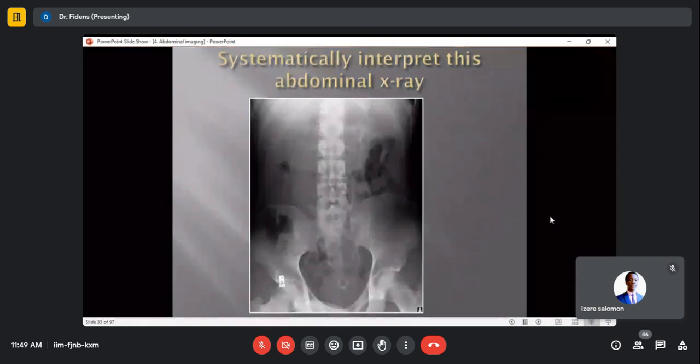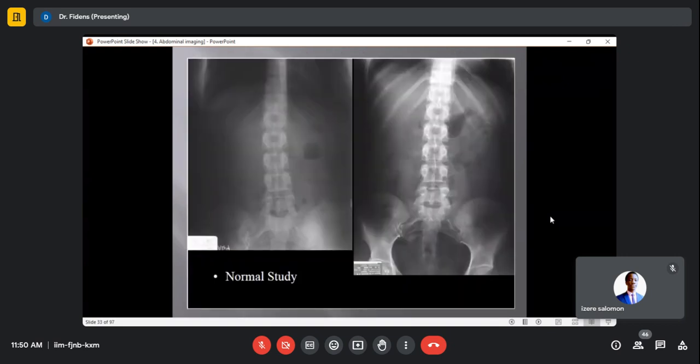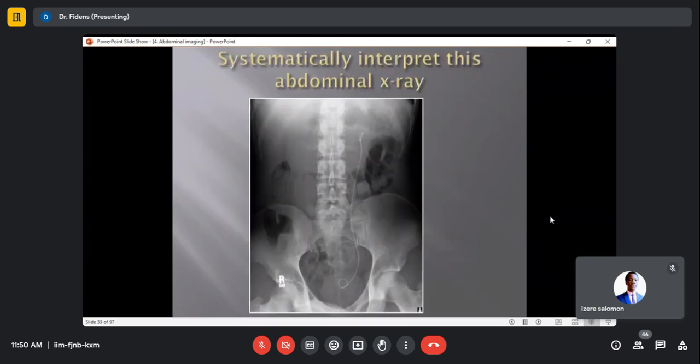Question. You can summarize for us a little bit how to approach this structure in 2 minutes, just systematic. Which structures? This one, as we have been discussing it, but you can go through it as someone experienced. I don't get the question. I'm just requesting to summarize for us how to go through it in a systematic way. Oh, okay. It's very simple.